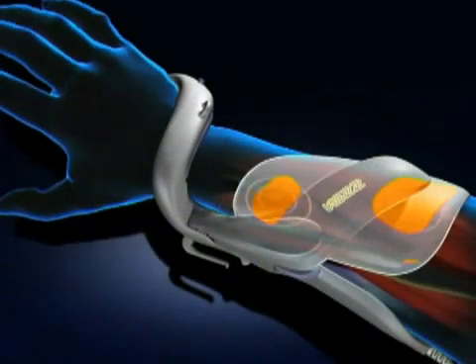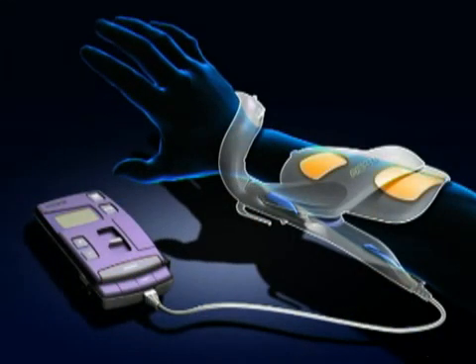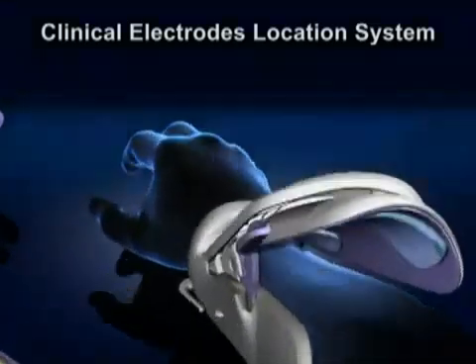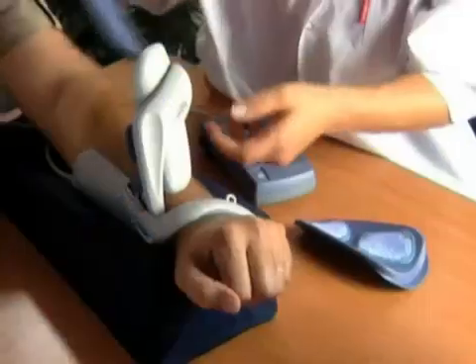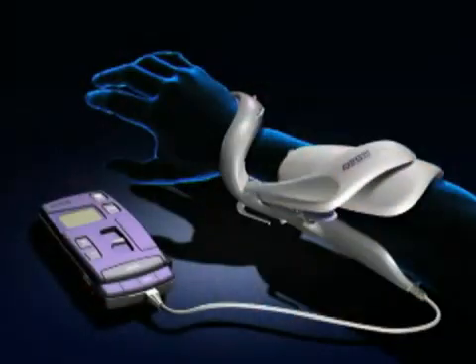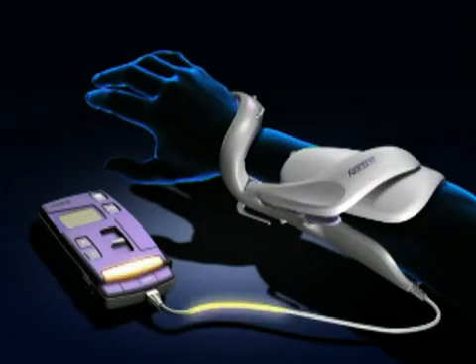The formerly difficult process of finding the accurate placement of each electrode was simplified with the Ness H200's patented clinical electrode location system. The system allows for quick detection of the best position of each electrode and its placement in the Ness H200 orthosis for each individual user.